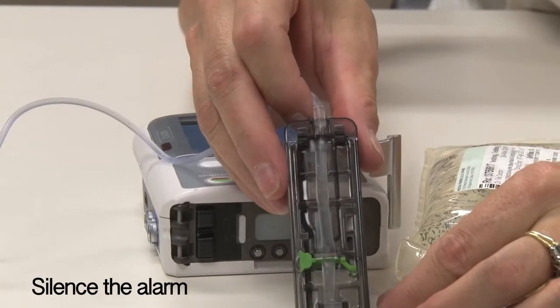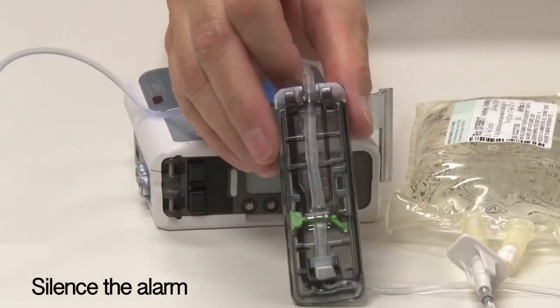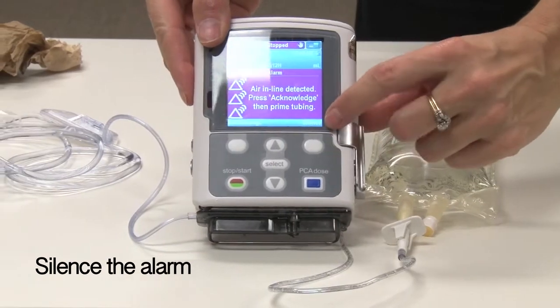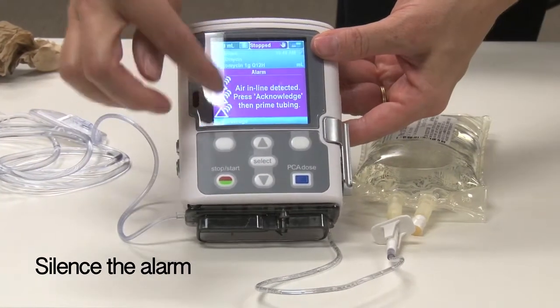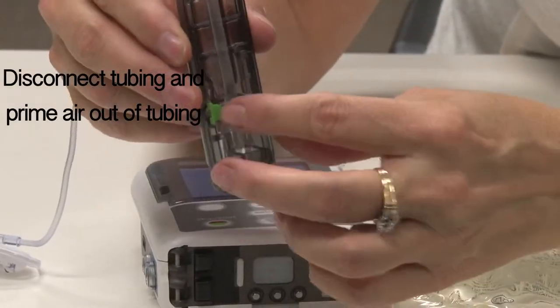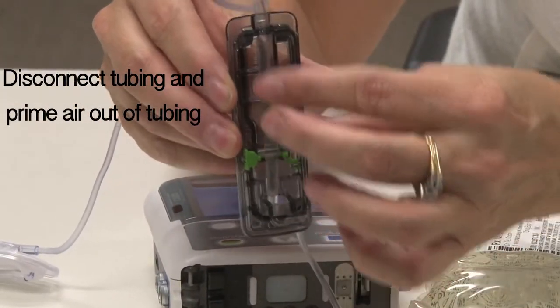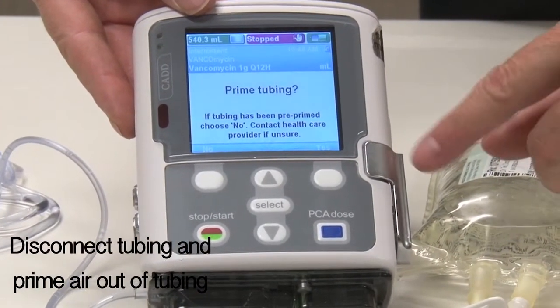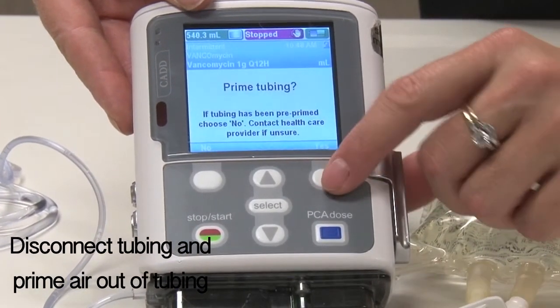When the pump detects air in the fluid path in the cassette, the pump will alarm air in line and stop running. You will be prompted to press silence and acknowledge to clear the alarm. Inspect the tubing, including the portion in the cassette. If air is visible, when the pump asks 'prime tubing,' press the white key below that indicates yes.